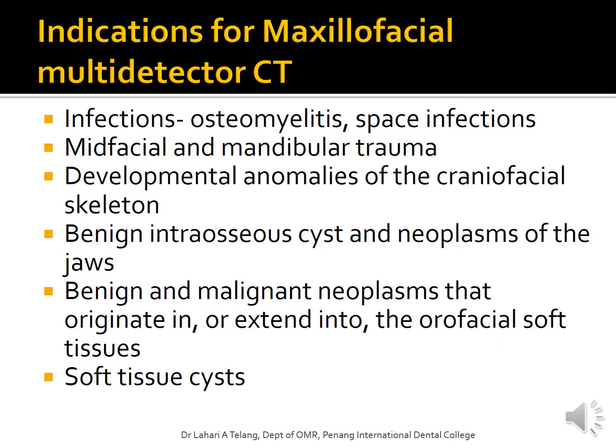So the indications for a maxillofacial CT scan would be infections like osteomyelitis or space infection, midfacial and mandibular trauma, very useful in cases of trauma, developmental anomalies of the craniofacial skeleton, benign intraosseous cysts and neoplasms of the jaws, benign and malignant neoplasms that originate in or extend into the orofacial soft tissue, and soft tissue cysts.